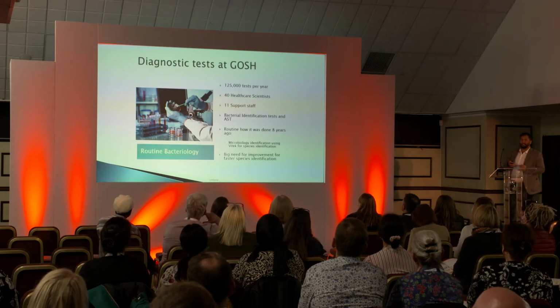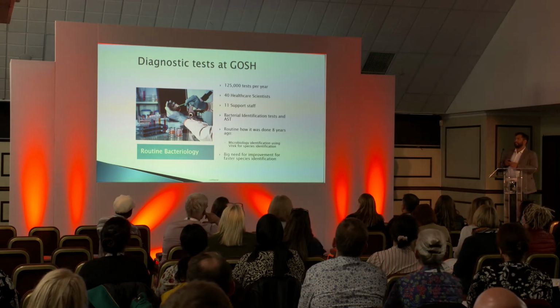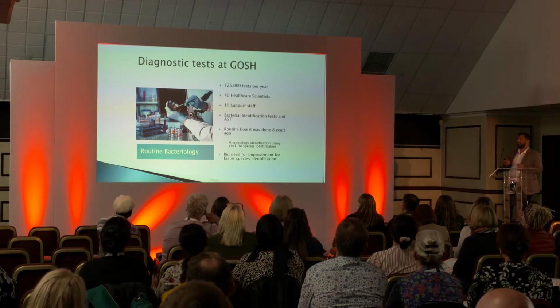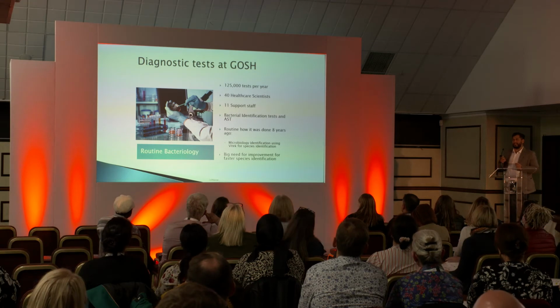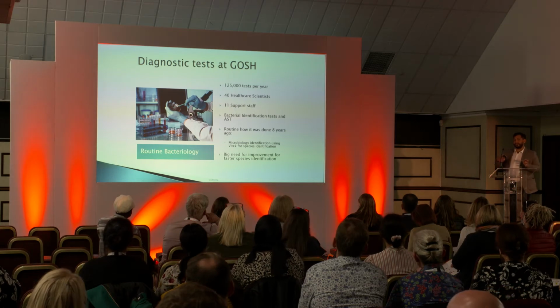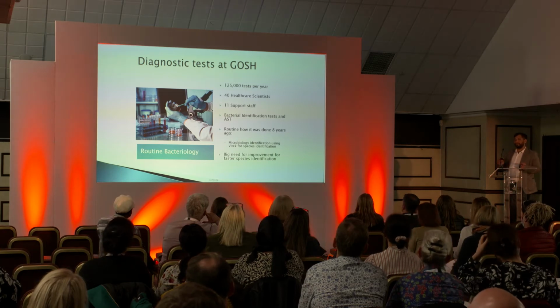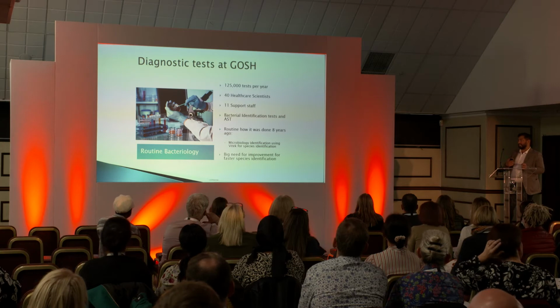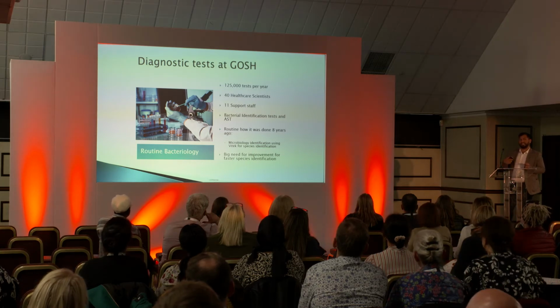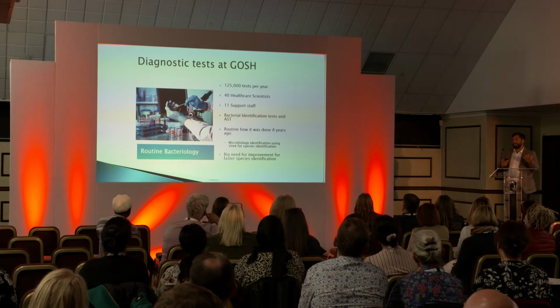I always like to talk about the lab as a scientist, and I think it plays a crucial part in diagnostics. So a little bit of the background of the microbiology laboratory at Great Ormond Street Hospital. So we do about 125,000 tests per year, which may not sound like much compared to other labs, but again, our lab is on site, which we're very fortunate about, and it actually focuses on our patients. We have 40 healthcare scientists, a mixture of different groups, which include biomedical scientists, clinical scientists, 11 support staff, so that's medical laboratory assistants who have a crucial role of actually checking when the sample comes into the laboratory that everything's labelled correctly, it's the right patient, the integrity is correct, we can perform the test, otherwise we need to contact the service user.